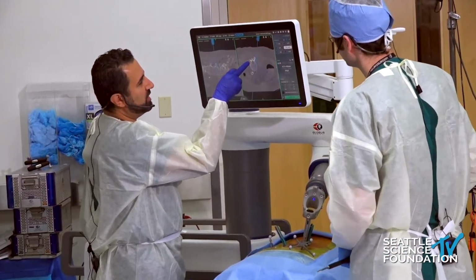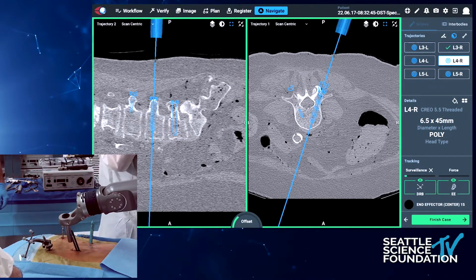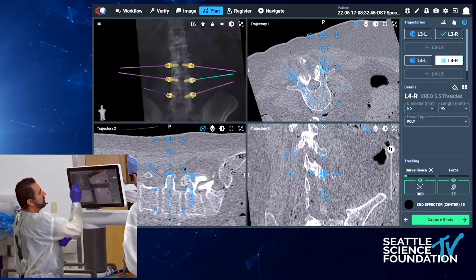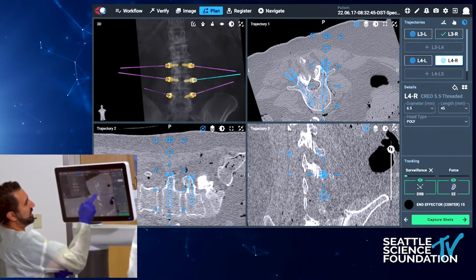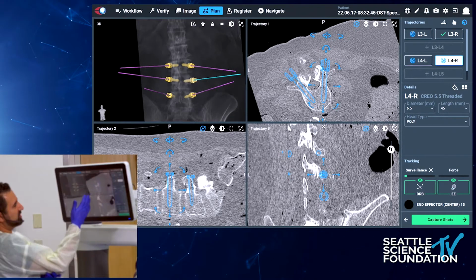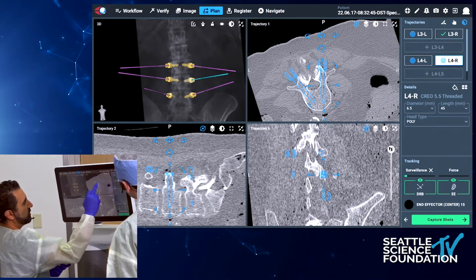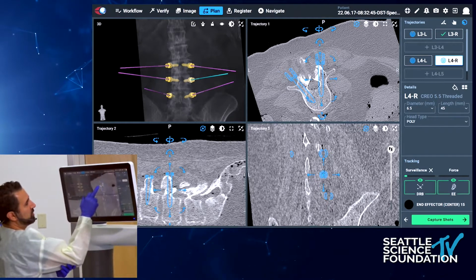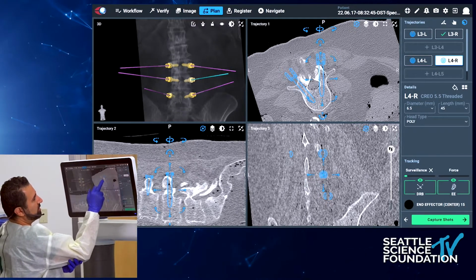So for example, you can see that the screw head is coming down the superior articular process of that level below, and it's at an awkward angle. If that's the case, let's say I'm just not happy with that placement, then I can go back to my original plan. It's the right L4 screw. So Jens, I'm able to translate it and seat the head of the screw in a more, if you like, safe position, as opposed to, let's say that we had this situation here, where my screw head, and I don't know how well you can see it, is really on the cusp of that superior articular process coming down the mountain, if you like, onto the TP. And that wouldn't be an acceptable position.